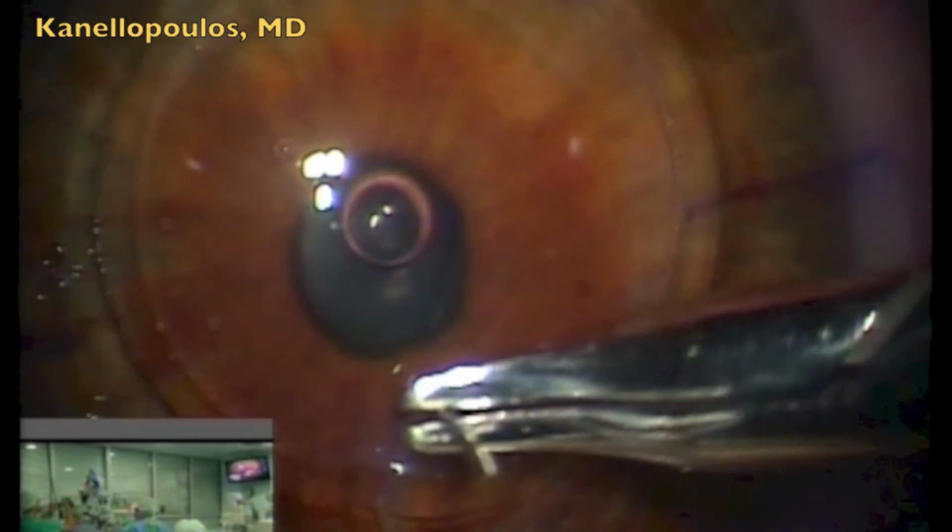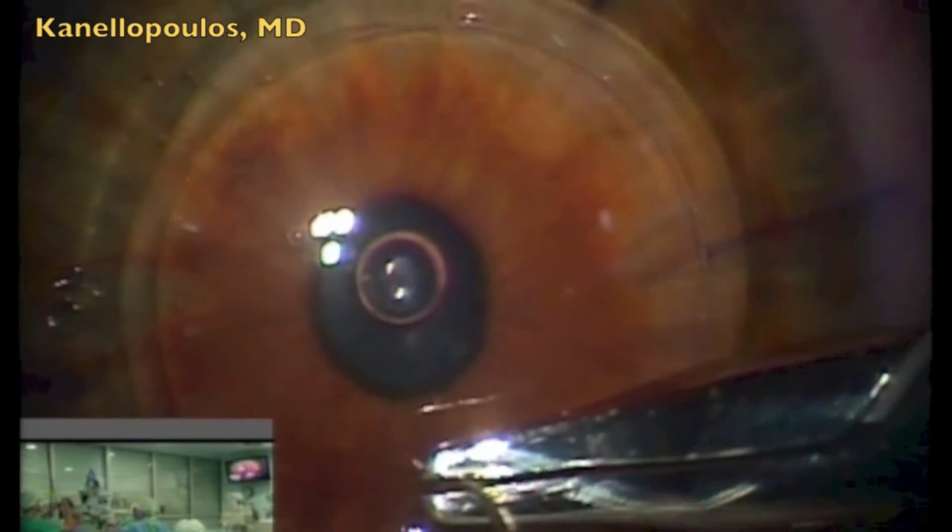We need to suture as deep as possible and accommodate the step both on the donor and the host.